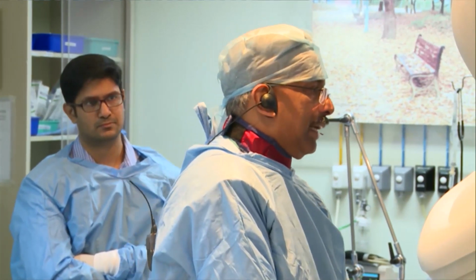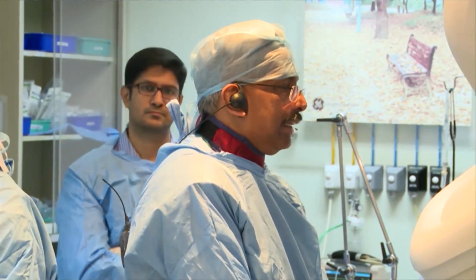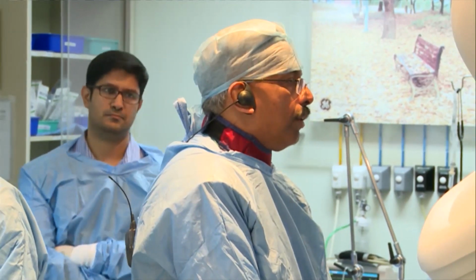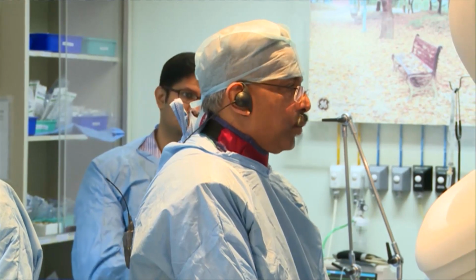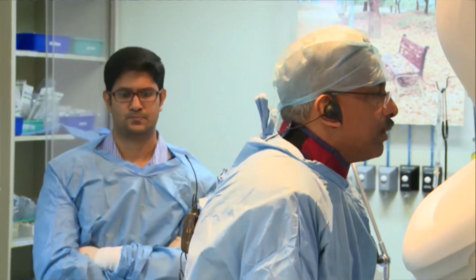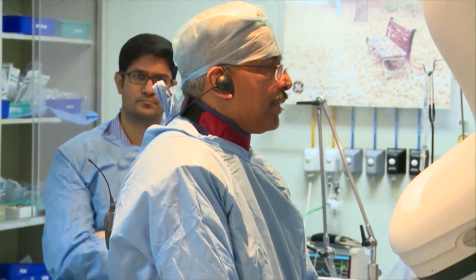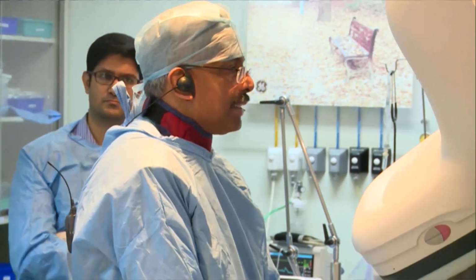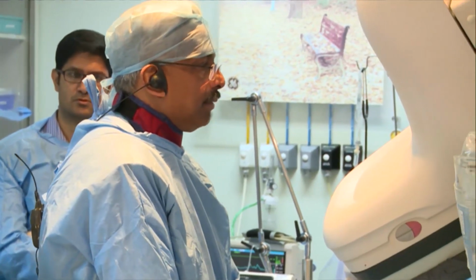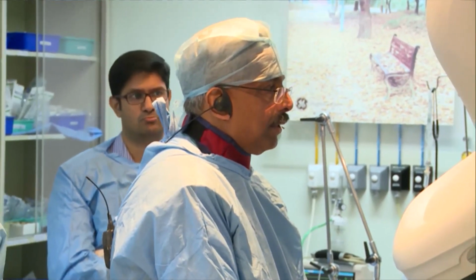It's clearly the patient had a lateral MI and a posterior wall MI, so it cannot be with the LAD. So obviously the culprit was the vessel that was totally occluded, so that was opened. Well, obviously the LAD could have contributed, and that is the reason that we took him back because he's been in hospital for about 7 days and still requiring NIV and Lasix infusion, and he still is dependent on supportive treatment.